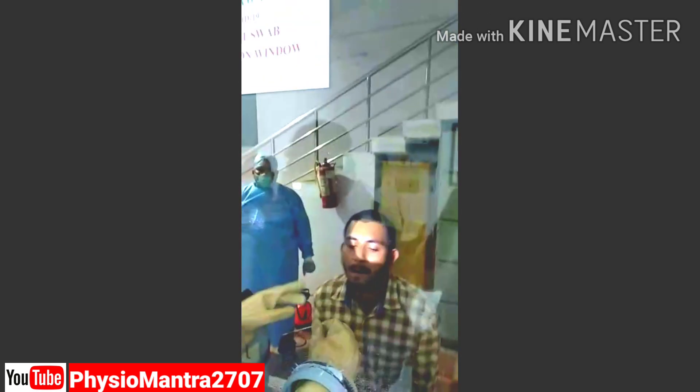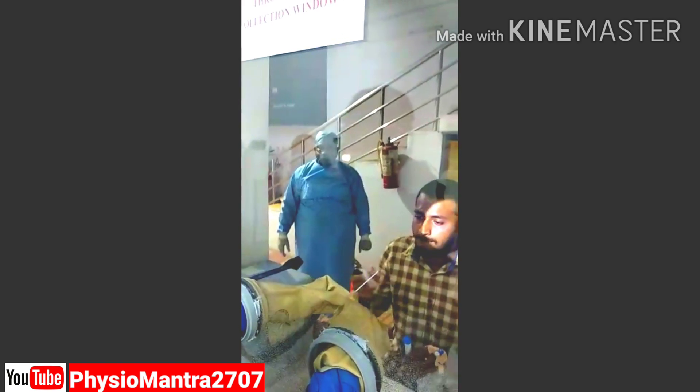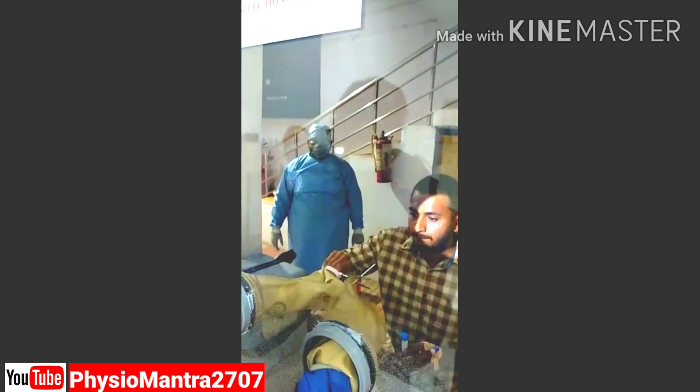That is the time when the patient is prone to cough, and that is when the glass pane helps in protecting the doctor.